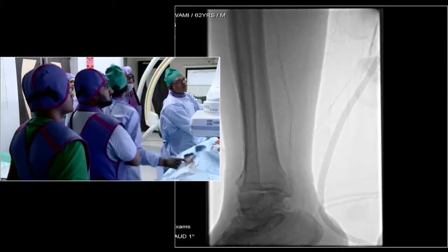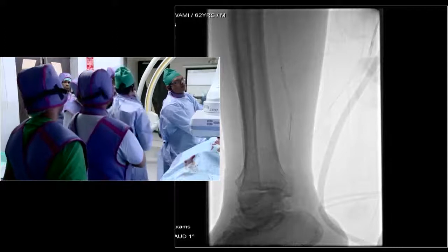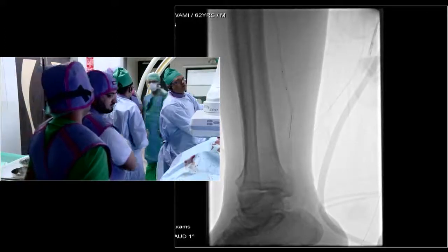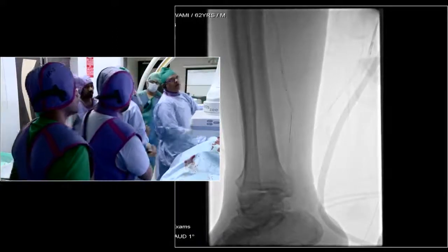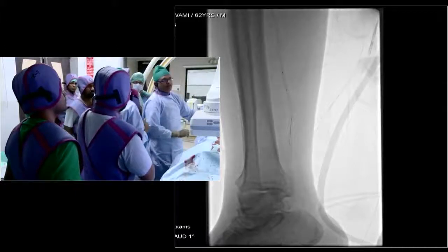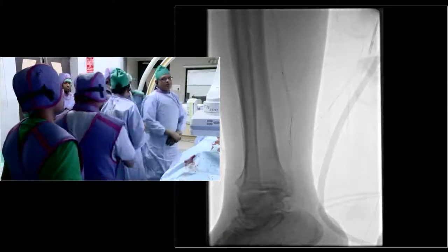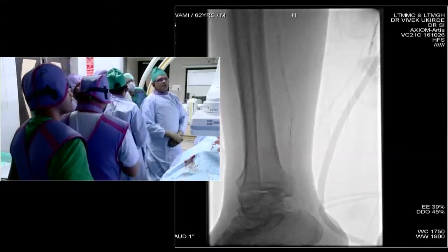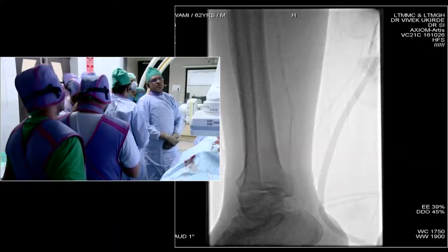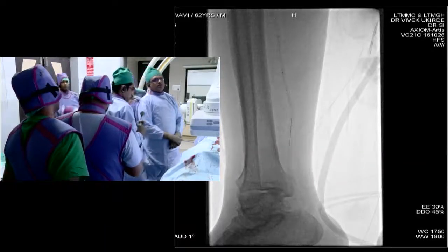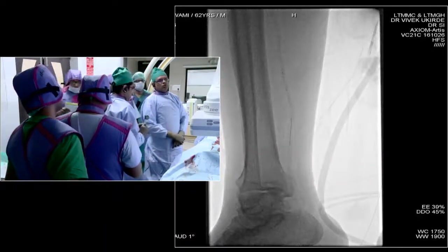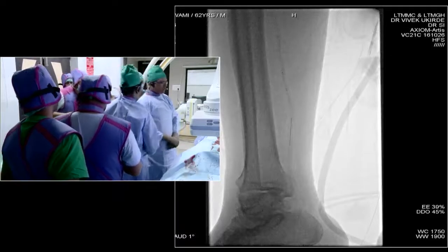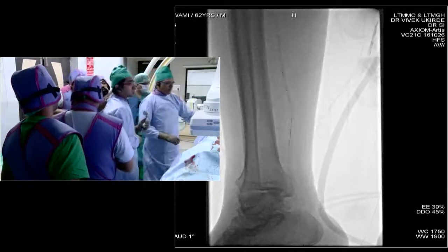Do you use roadmap for positioning? We have marked the lesion location on the screen with a marker, because I was expecting that after initial angioplasty I may not be able to see that particular lesion. There are various ways to mark the segment — I have marked it on the screen.